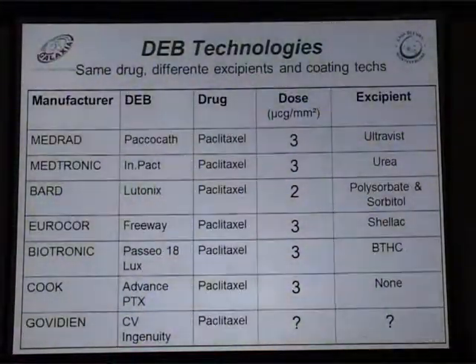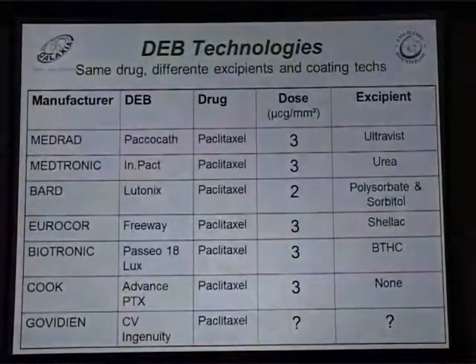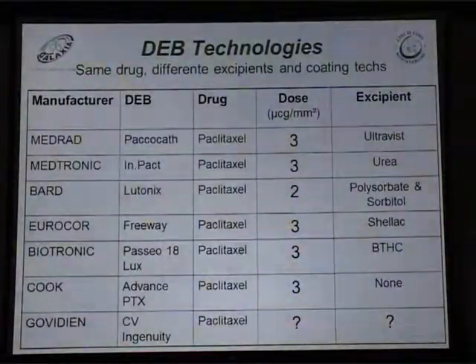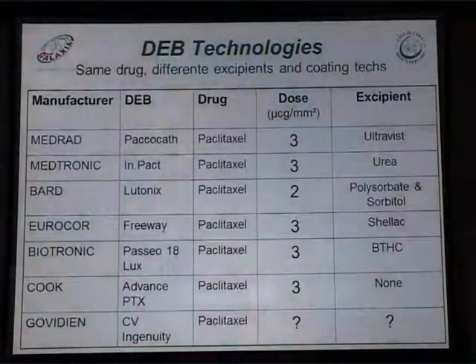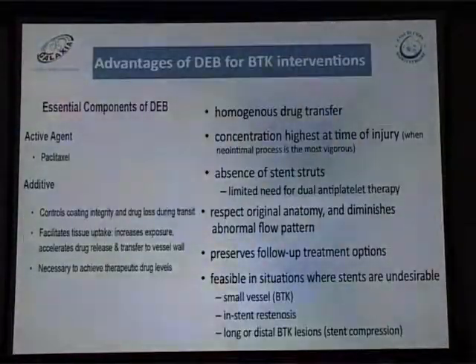multi-center studies. Regarding drug eluting balloon technologies, many companies, you see, make these balloons using the same drug, different excipients, and coating technologies. The drug is usually paclitaxel with nearly the same dose, 3 micrograms per square millimeter of balloon surface, with different excipients. Let's see. The most studied drug-coated balloon is the IN.PACT balloon from Medtronic.